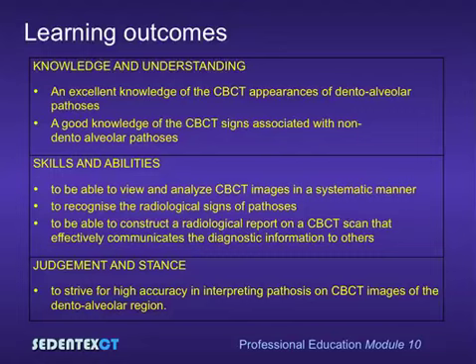In terms of knowledge and understanding, we anticipate that you will achieve an excellent knowledge of the cone beam CT appearances of dentoalveolar pathoses, and a good knowledge of the cone beam CT signs associated with non-dentoalveolar pathoses.